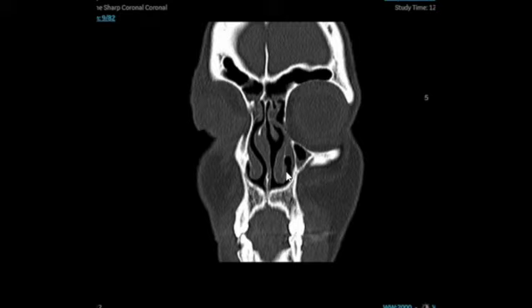One of the things is, whenever you want to do any surgery to the inferior turbinate, outfracture, one of the methods of doing the outfracturing is you first infracture and then outfracture. That is, you place your Hill's elevator or Freer's elevator in this area, push it this side, then put your elevator in this area, medial to the inferior turbinate and lateral to the septum, and push it outwards.